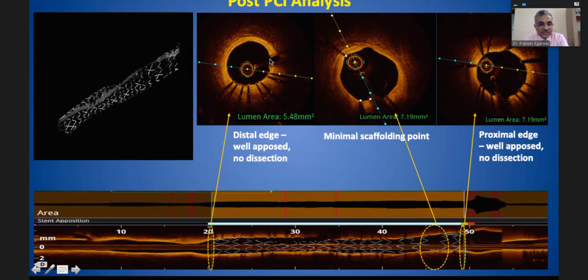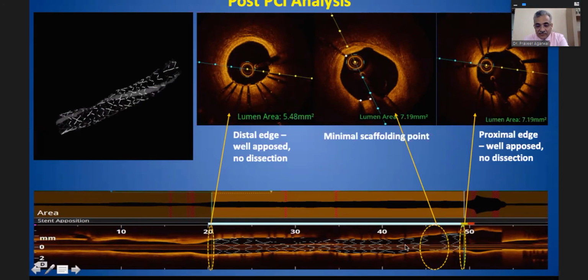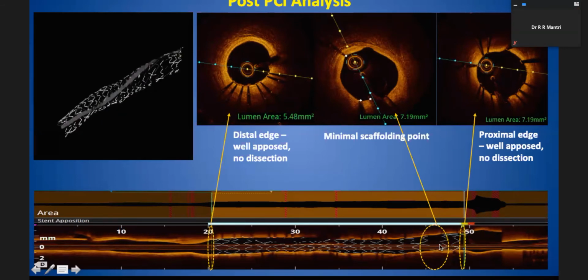Here you can see the struts, they are very well defined. But in the center, near the proximal edge, you can see it here also, the struts are widely apart and they are not as close as in the normal architecture of the stent. Here the stent has gone elongated.